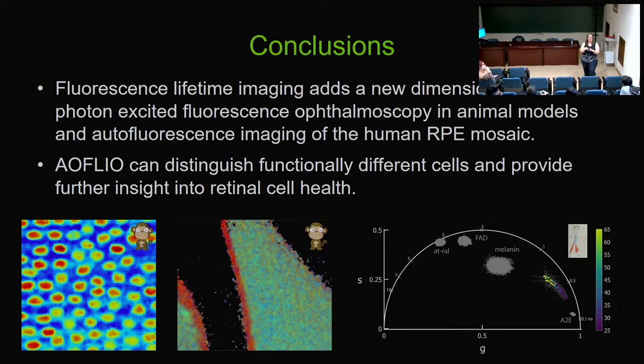the molecules within RPE cells, the composition of RPE cells, changed, and it was differing as you aged, and it was differing with eccentricities. They have, I don't have the paper here, I wish I did have it, gorgeous figures where they showed that basically what you get within a cell is different. And so we think that that difference of relative contributions is what is key here.